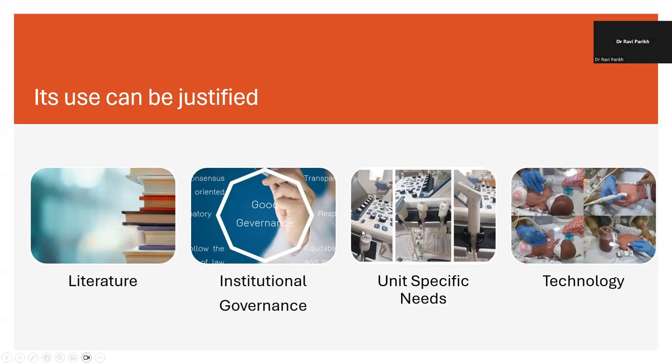Now, you might be able to optimize that if you're able to change your focus to the level of the pleura or by reducing your depth, as has been demonstrated today again. So you will need to define this in your guidance, because really you're using a probe that might not give you the necessary images, but more importantly, it's really being able to implement that technology in practice. And this is where I would say to you that you mitigate your risk by gaining the skill.